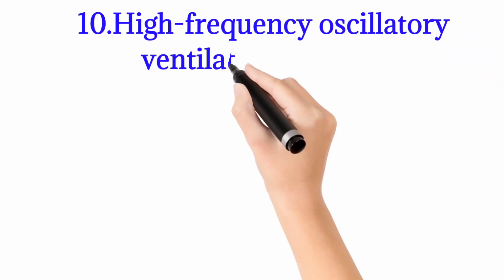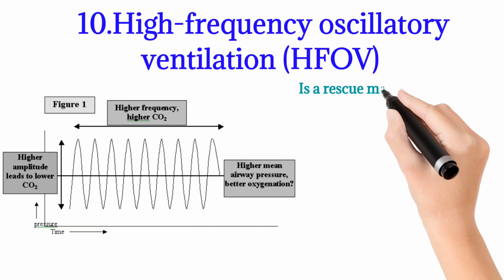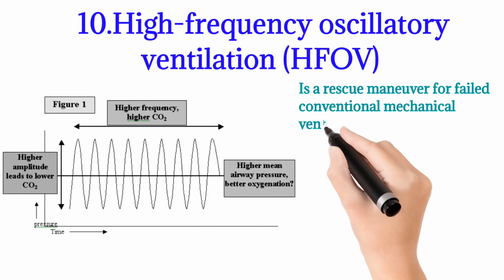High-frequency oscillatory ventilation, HFOV, is a rescue maneuver for failed conventional mechanical ventilation.